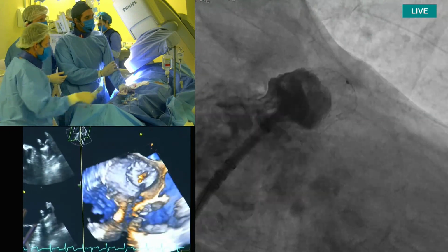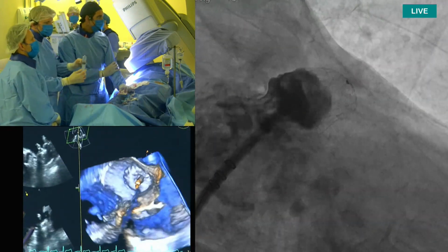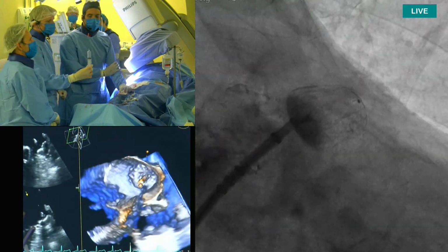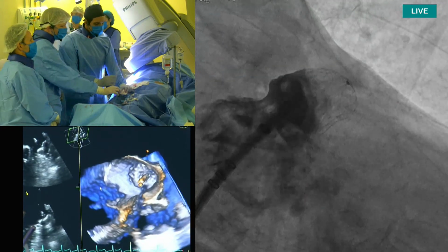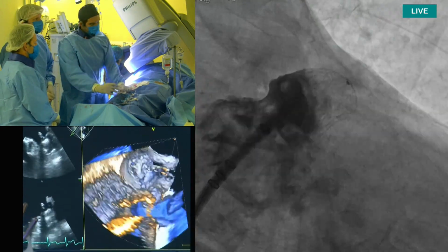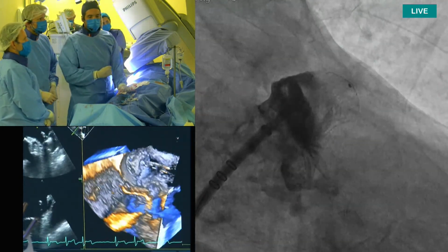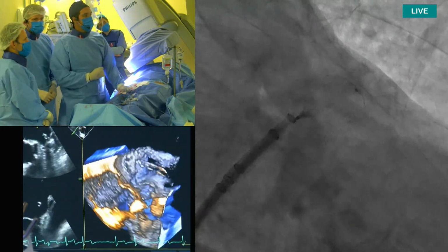Yeah, and there is a very high likelihood that it's going to occlude completely, even on CT. It follow-up CT. So let's do a tug test maybe, Felipe, then you can open up the hemostatic valve at the end. We can pull back a little bit on the... Yes, can we have a microphone for Dr. Monica from the echo? She's going to talk about some of the best criteria.